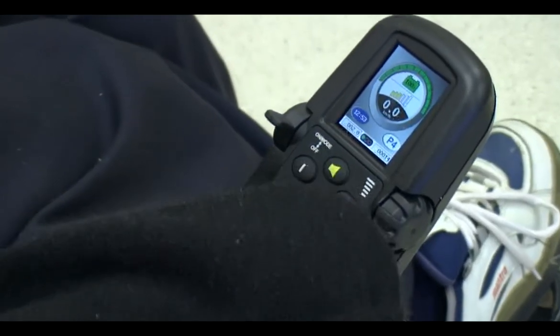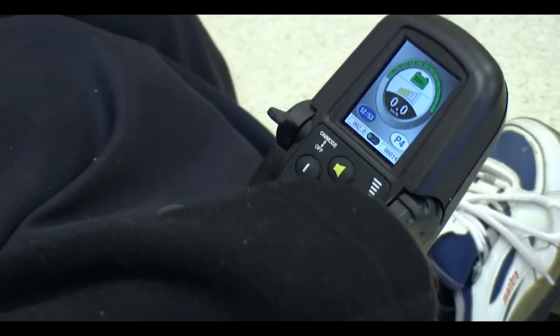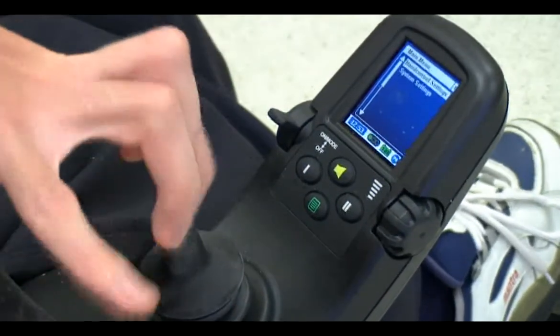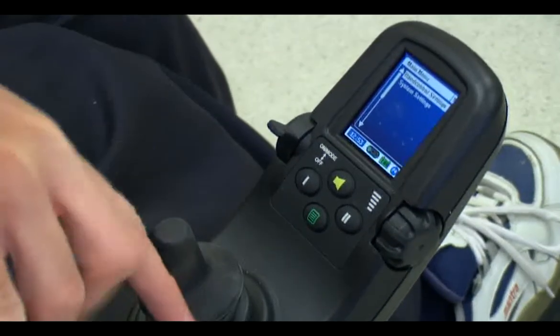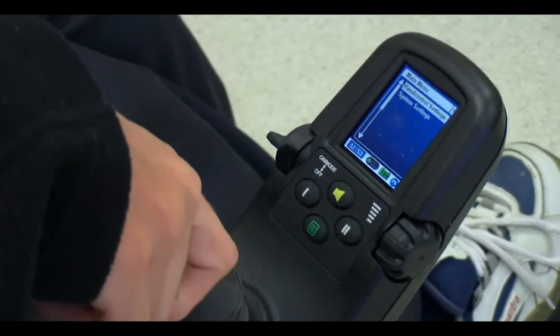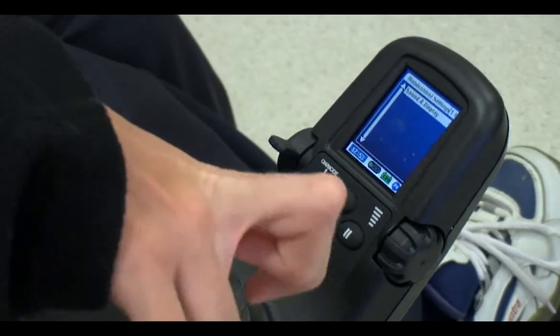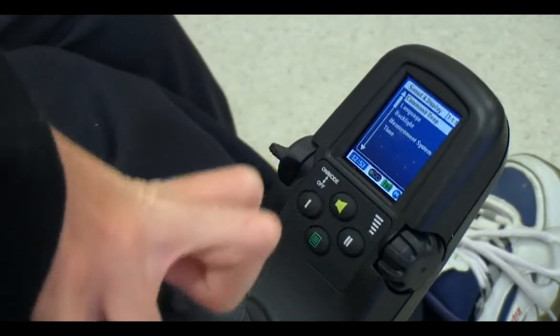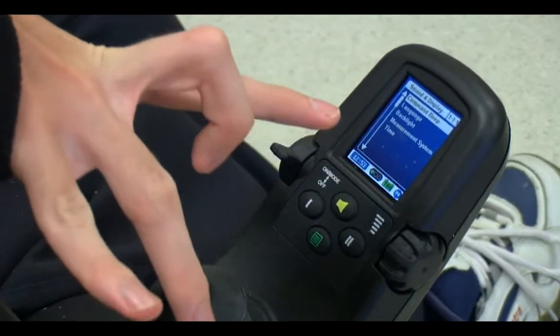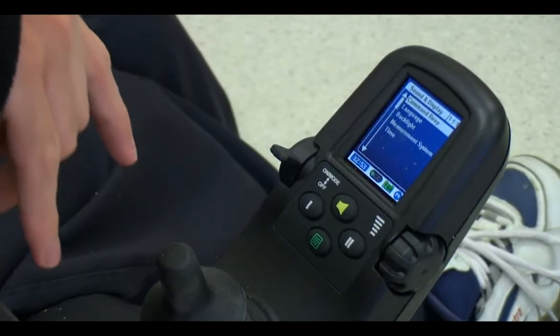Just push this green button here. When you push that, the menu comes up, and you can adjust the hand control settings and adjust all those things.